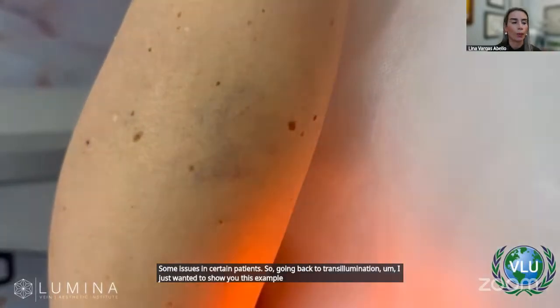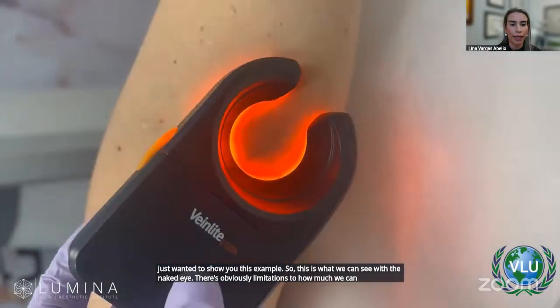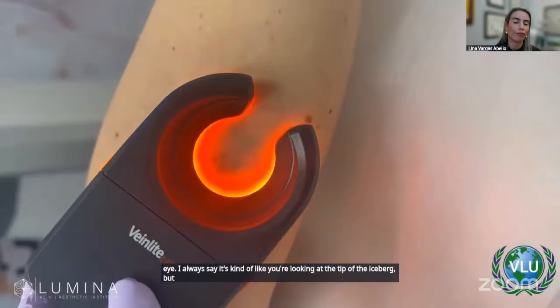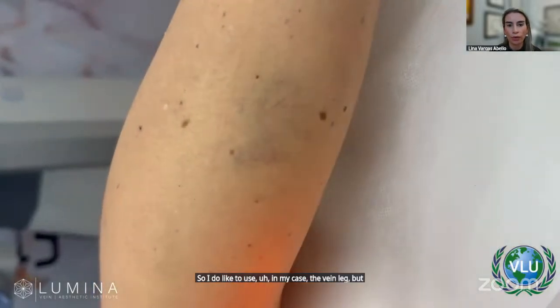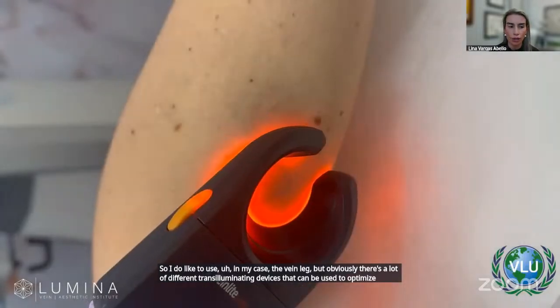So going back to transillumination, I just wanted to show you this example. This is what we can see with the naked eye. There's obviously limitations to how much we can see with the naked eye. I always say it's like you're looking at the tip of the iceberg, but you're missing everything else that's under the water. So I like to use, in my case, the vein light, but there are a lot of different transilluminating devices that can be used to optimize your visualization of these veins.